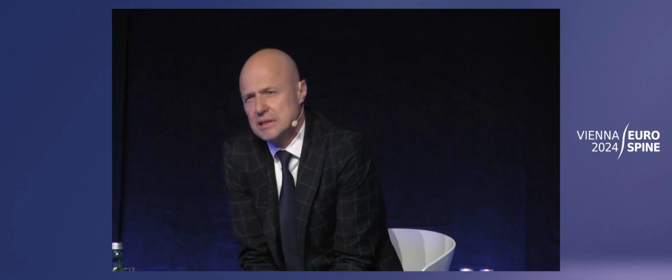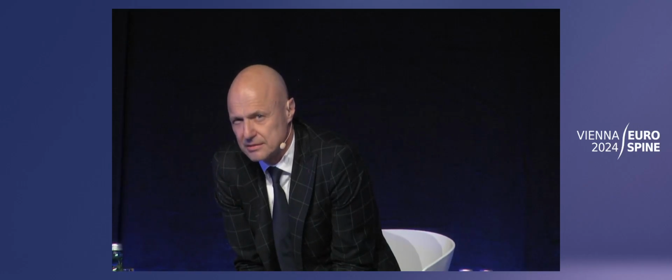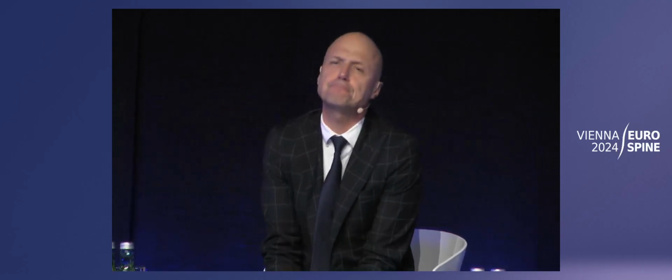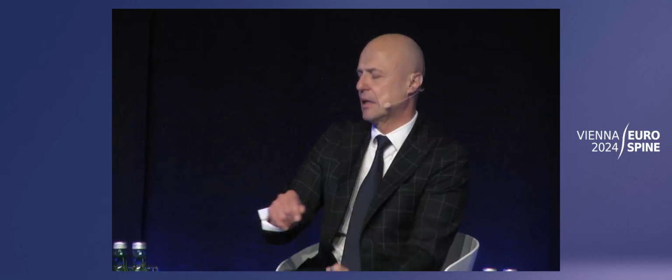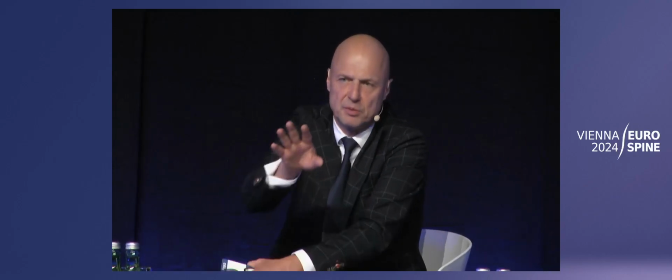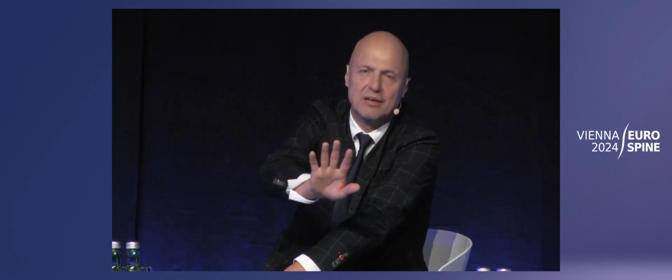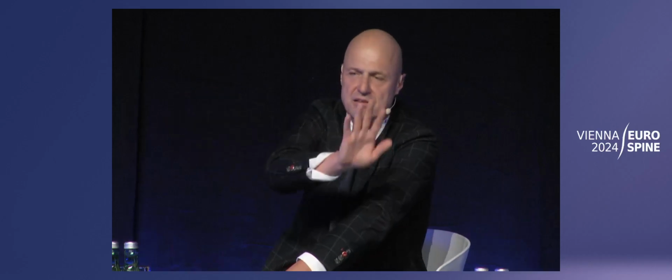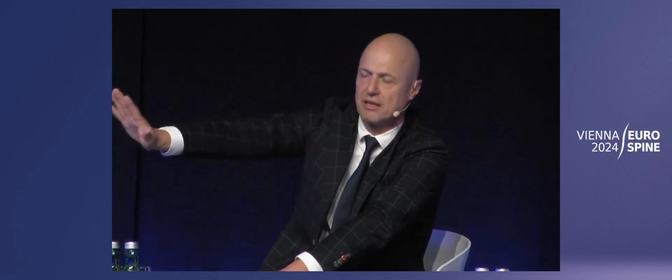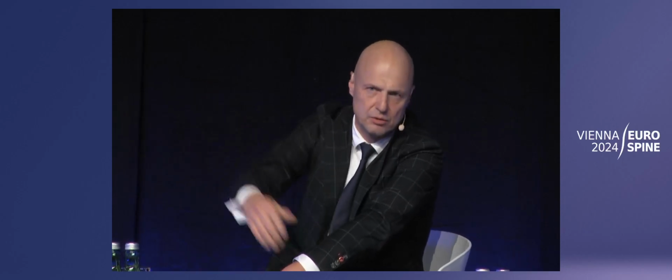And to use artificial intelligence to do what? Because we know so much about what it looks like, that we could use this additional information from CT to further advance our MRI and understanding. Clearly, that's also something that is feasible. If you have an MRI and the CT at the same time, you can use that as a source and the target and educate a neural network.